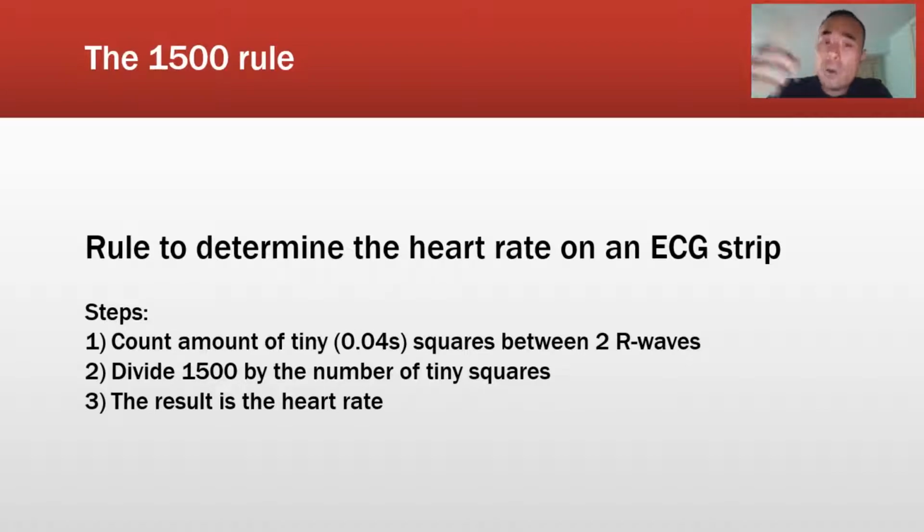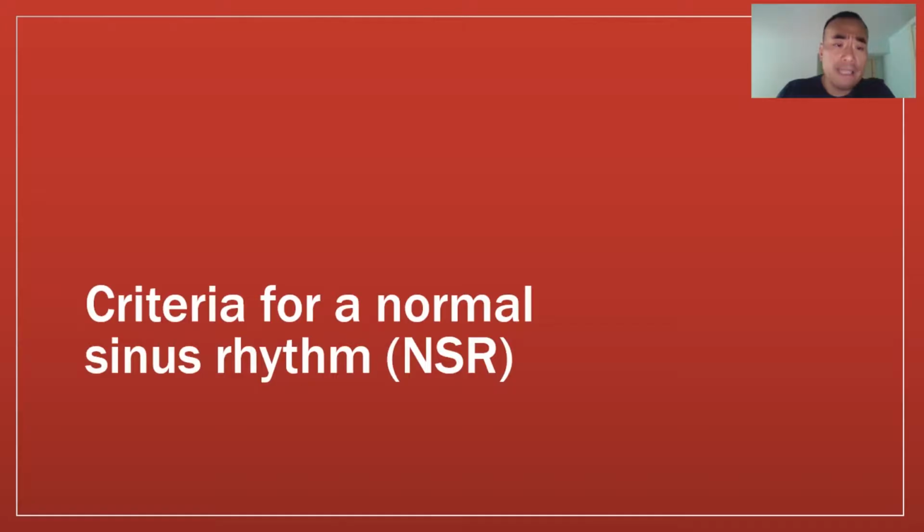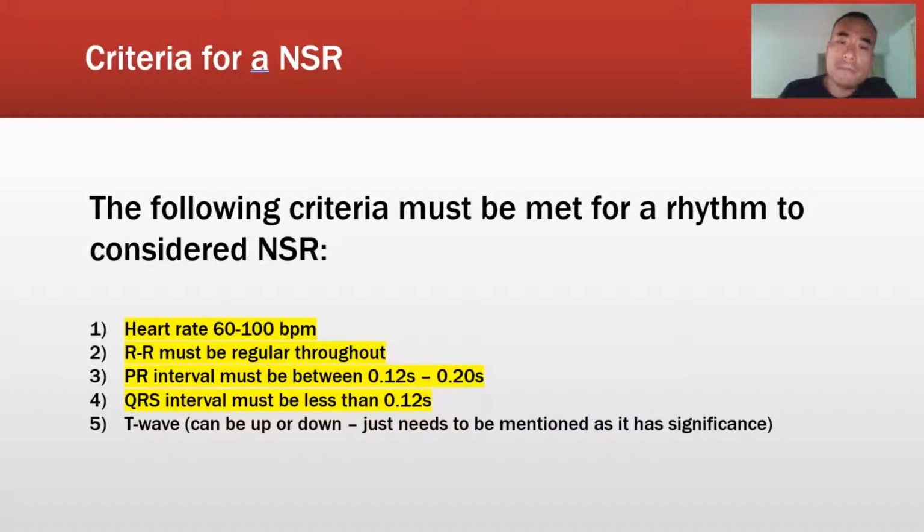We have some examples at the end of this video, and hopefully it helps you visualize and connect all the principles together. It's as simple as that. All right, so we're going to go to the criteria for a normal sinus rhythm.